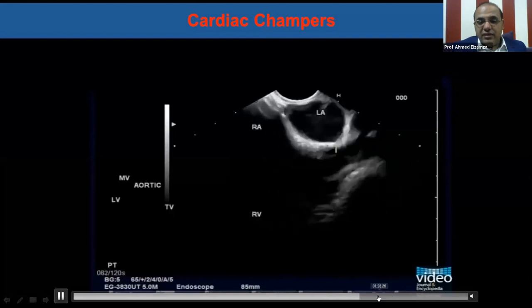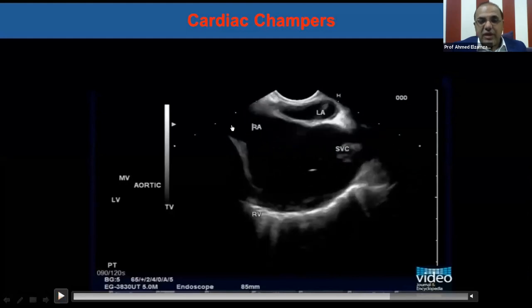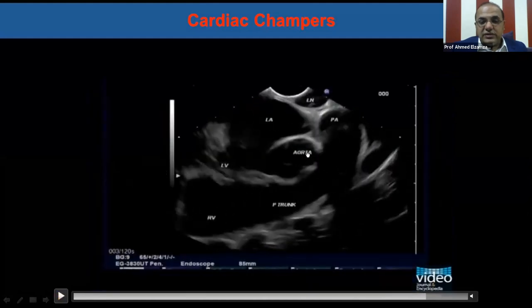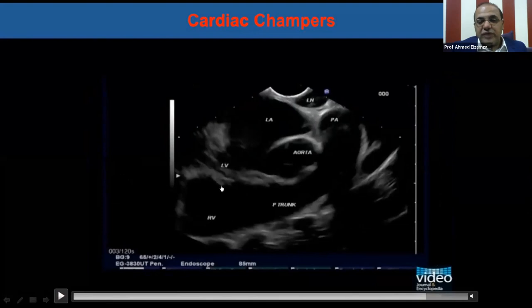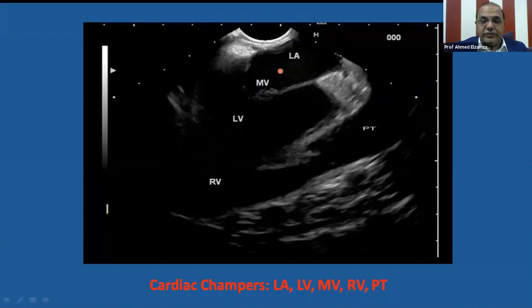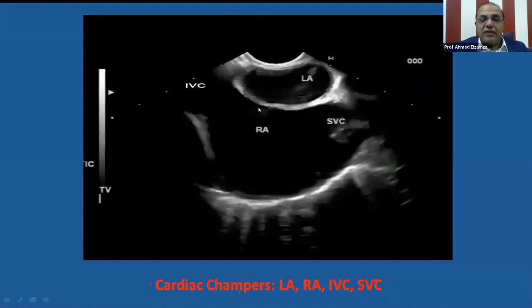With slight manipulation: this is the right atrium with the inferior vena cava on the left and superior vena cava on the right. This is an excellent view — the left atrium, right pulmonary artery, and lymph node station 7 subcarinal in between. This is the left ventricle, root of the aorta, right ventricle, and pulmonary trunk giving the right pulmonary artery branch. Again, left atrium, left ventricle, mitral valve in between, and the right ventricle giving the pulmonary trunk which divides to right and left pulmonary arteries. This is the left atrium and right atrium below it with insertion of inferior vena cava and superior vena cava.